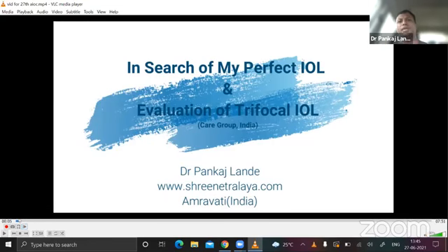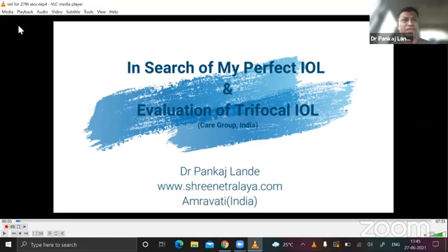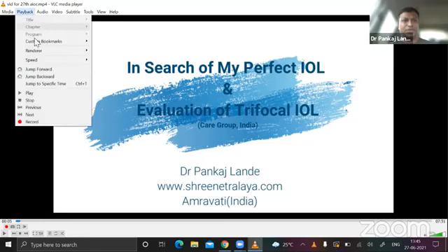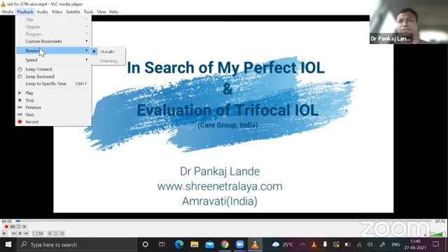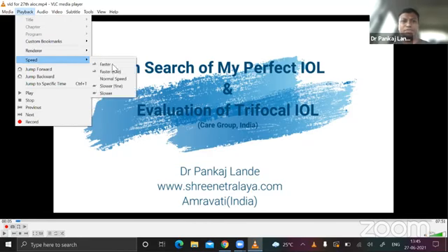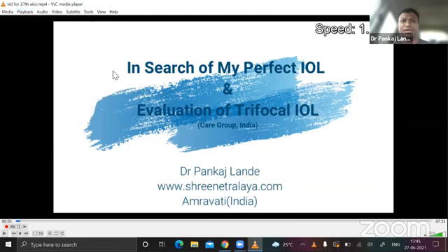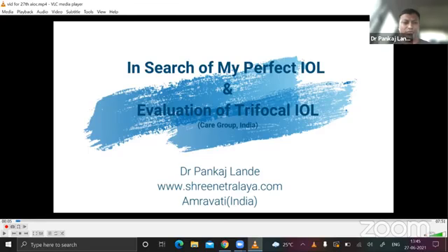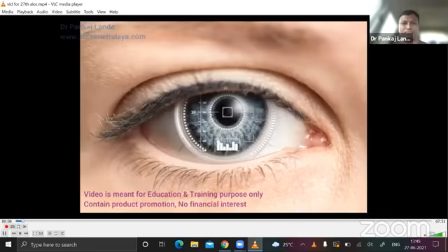As I was already in search of a trifocal lens which was working good for me, I found the IOCARE trifocal platform — the trifocal IOL is one of the best. I evaluated this lens with a few parameters and found it very useful. I'm showing a pre-recorded surgery. Hello friends, welcome to Srinetra Live.